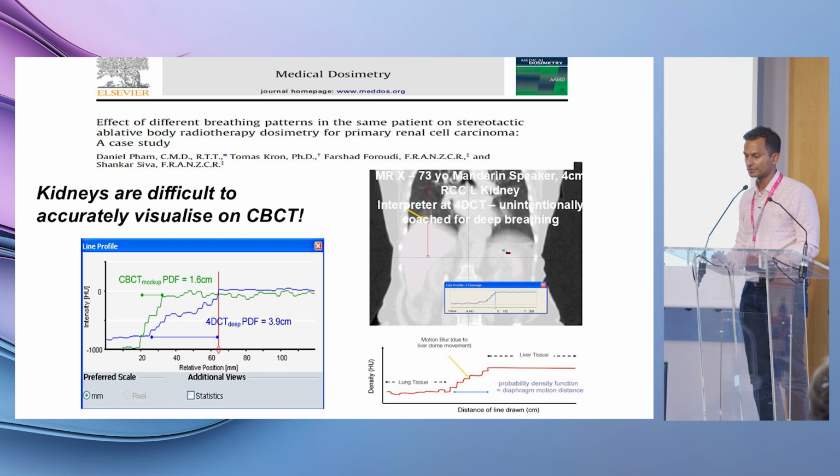Very simple techniques, very basic. The way we used to treat as well was very basic as well. It was using non-coplanar techniques. Now, all this morning, we haven't been talking about non-coplanar because everybody's moved to VMAT. It's very simple. We still use non-coplanar on occasion when we think it's the most optimal way to get a dose distribution. It's very rare. We don't use it that often. It's probably only in about maybe 1 to 5% of patients, but it is still an option.